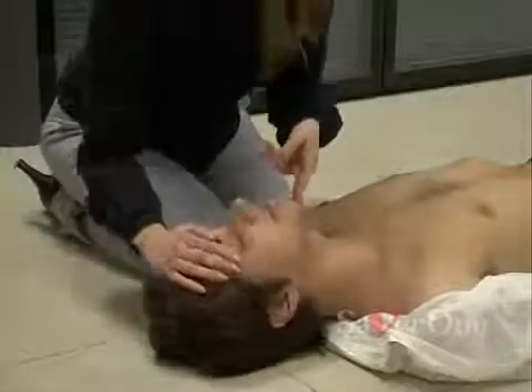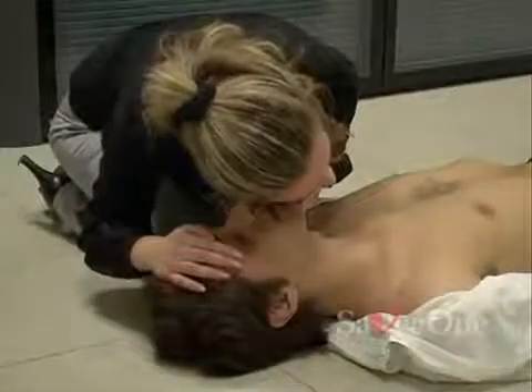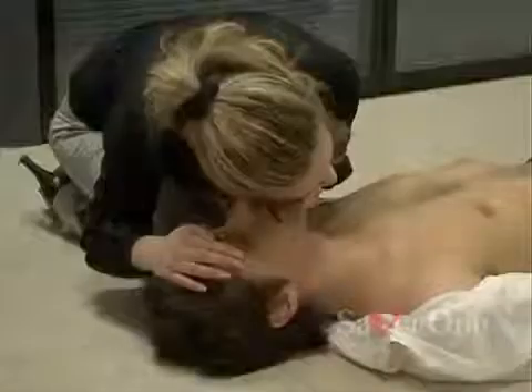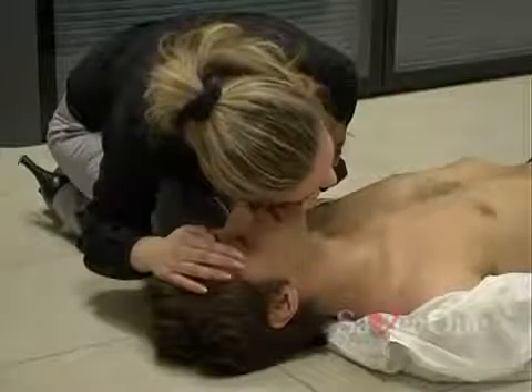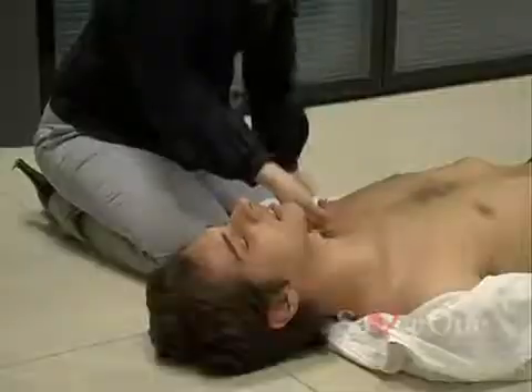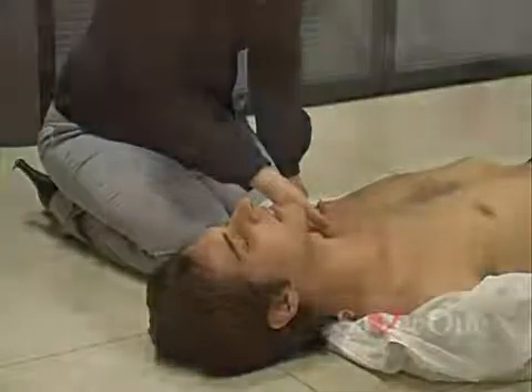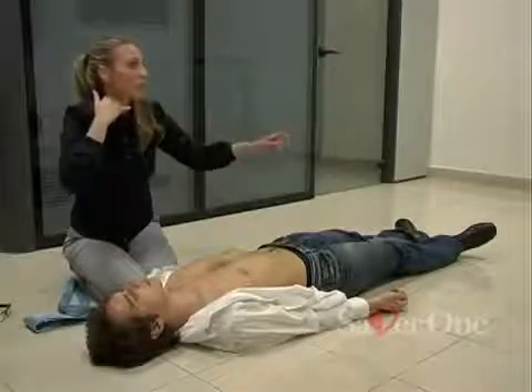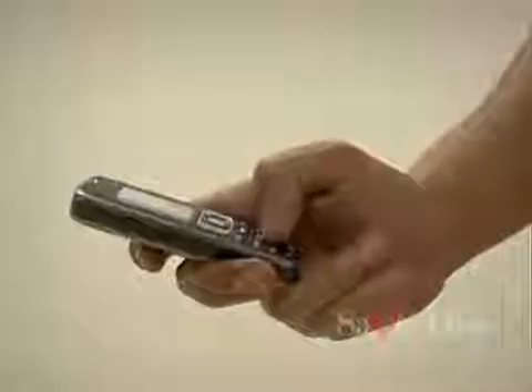Make sure the airway is open. Tilt the head back and listen for breathing. Look at chest movement, if any. Listen to hear any respiratory noises. Lean your cheek to feel if any air is flowing from the victim's mouth. Quick assessment of the pulse rate — check the carotid pulse. If needed, call the emergency and ask for a defibrillator.